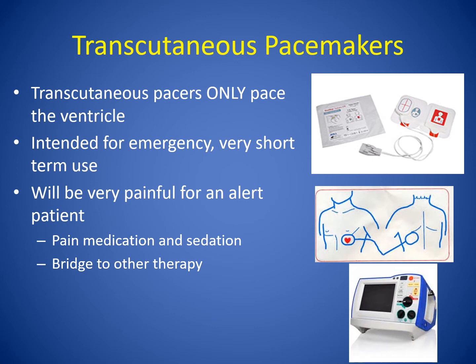Usually, these transcutaneous pacers are used as a bridge to other therapy. So we usually will have a patient that maybe has a medication that is causing a bradycardia, but once the medication has gotten out of their system, they will no longer need a pacemaker.